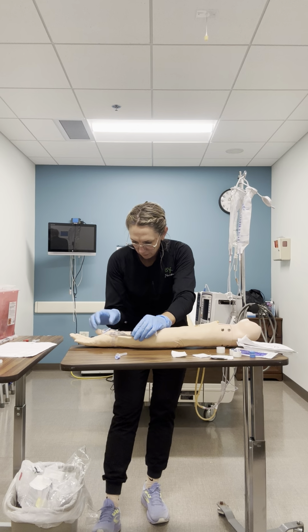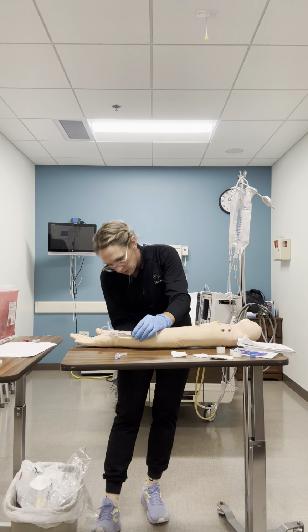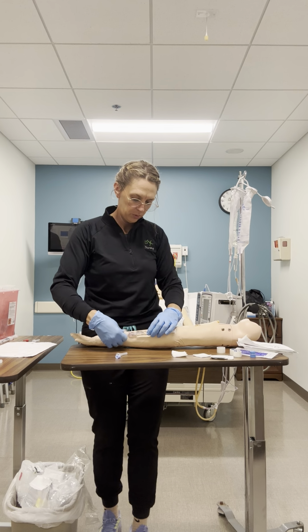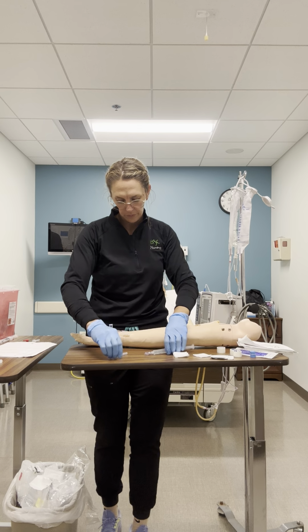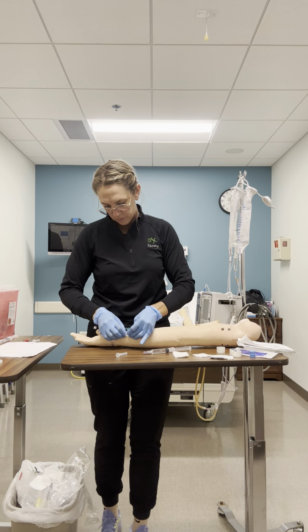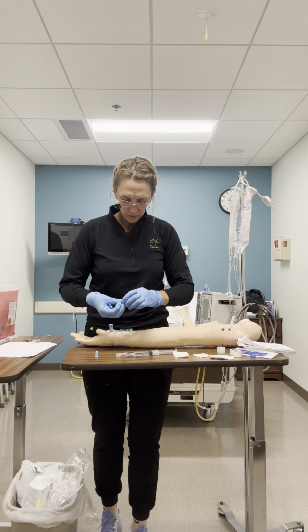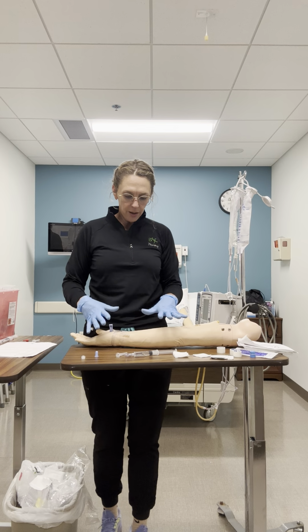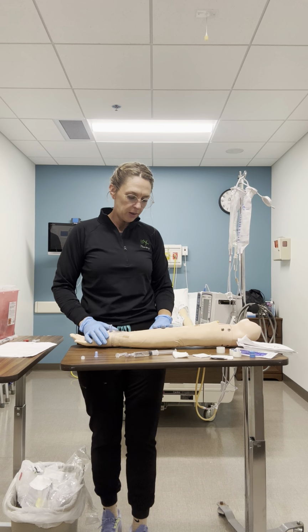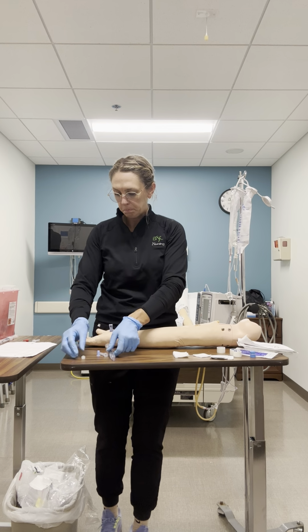And then once I have that flushed and closed, we will tape and disconnect. So, does this not have a lid? Okay. So now I have my saline lock in place, it's patent, and it's time to disconnect my IV.